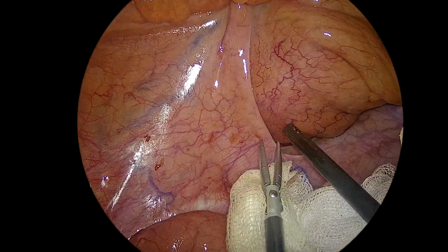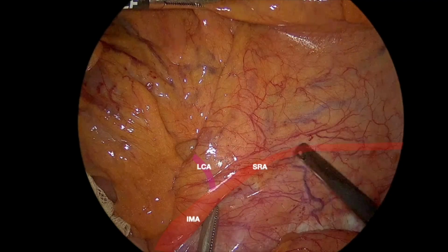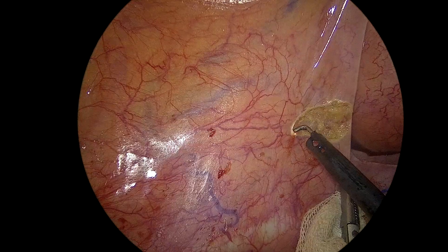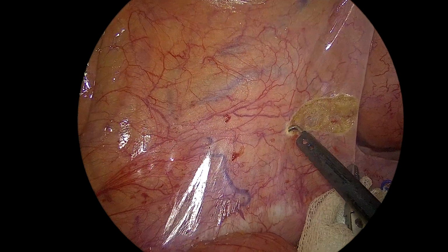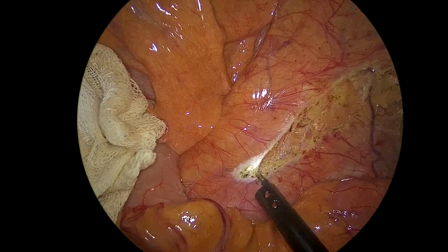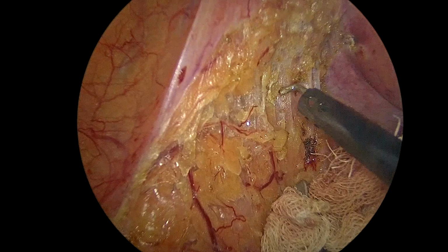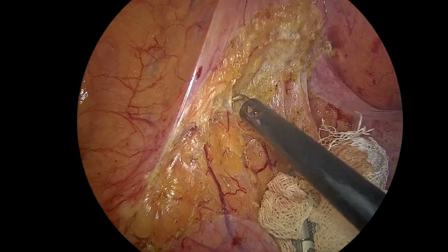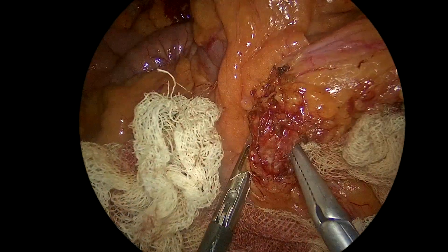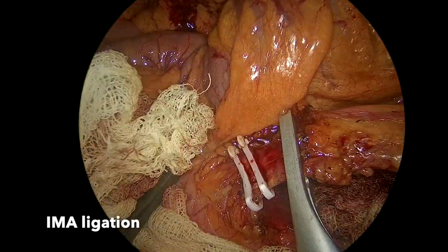IMA was identified and skeletonized. The bare area of the mesentery is divided. Ligation of the IMA with Hem-o-lok and bipolar device.